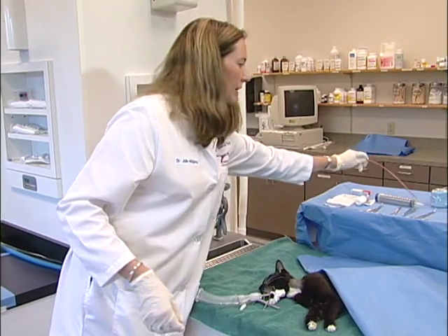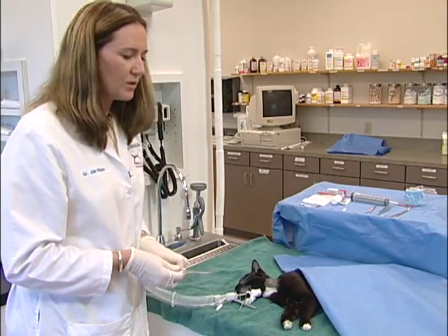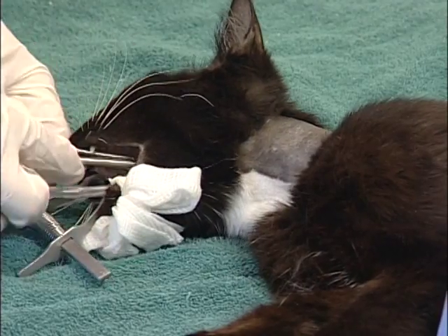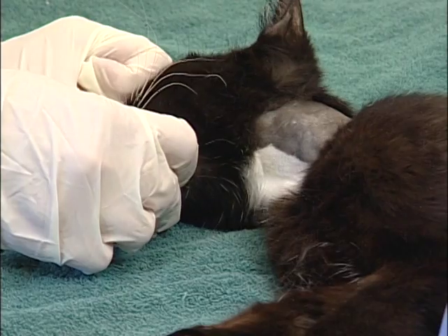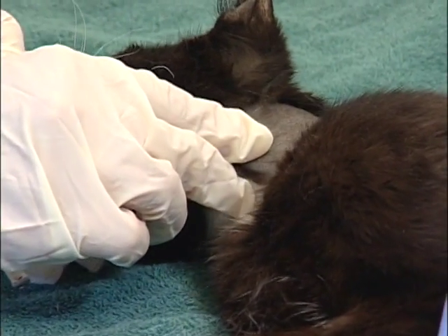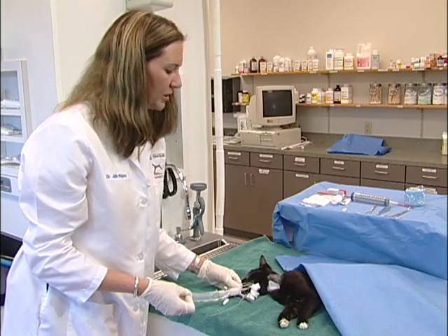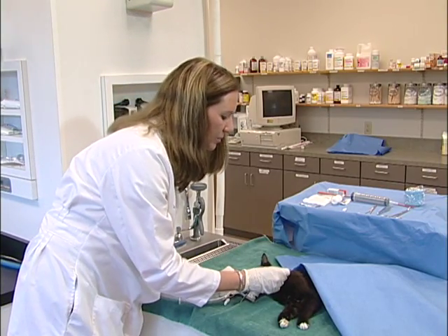Once you've decided on the length of tube that is required, you can go ahead and using your carmalt forceps, introduce the forceps through the mouth and into the mid-esophagus. The carmalt can be angled so that the tip is deflected upwards in the mid-esophagus. Note the vessels in the neck so that these are not penetrated. Once the carmalt is pushed upwards, you can go ahead and make an incision over the top of the tip of the forceps.